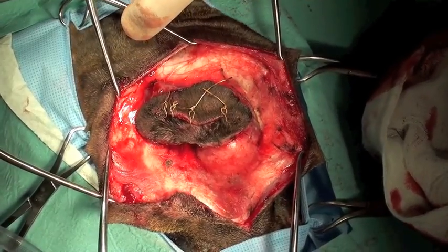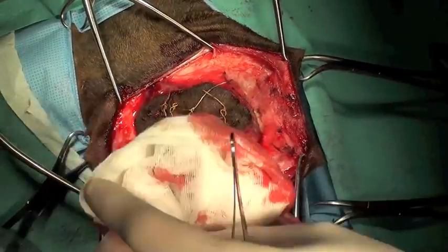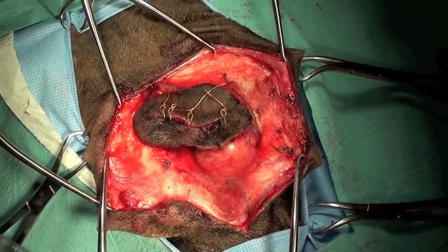At this point we can start to see the external ear canal cranial to the previous surgical site.